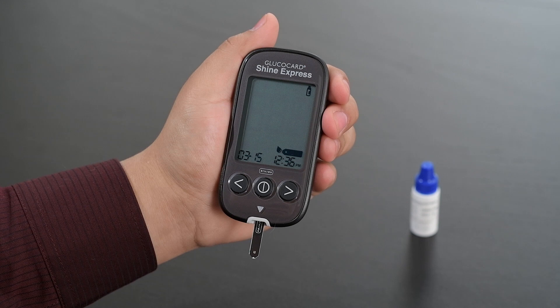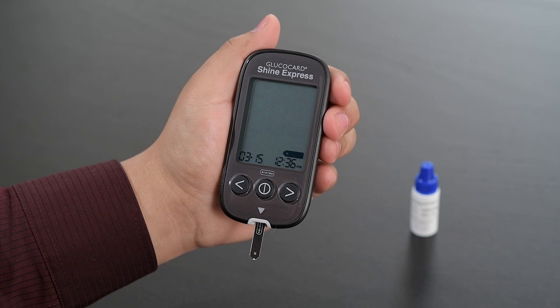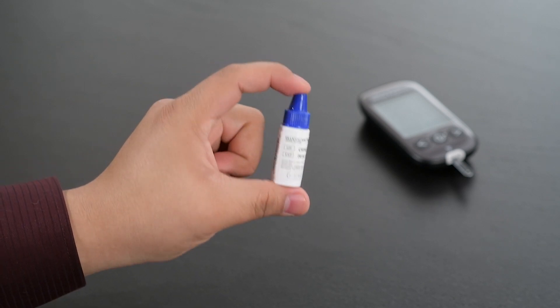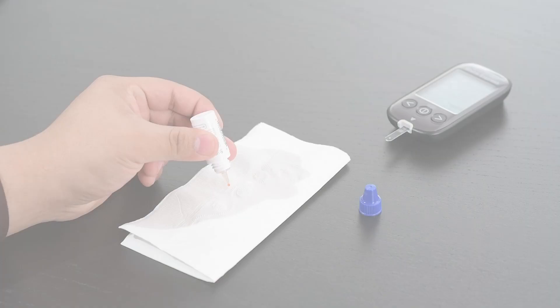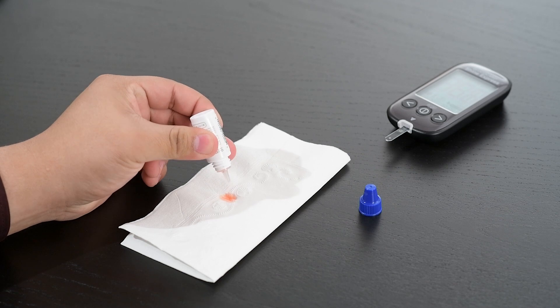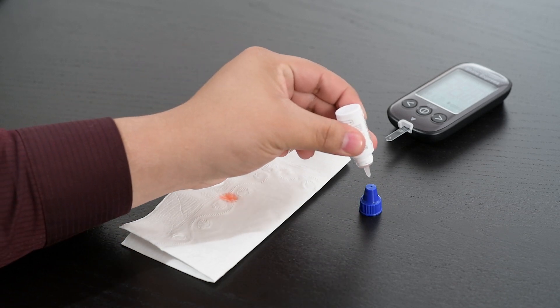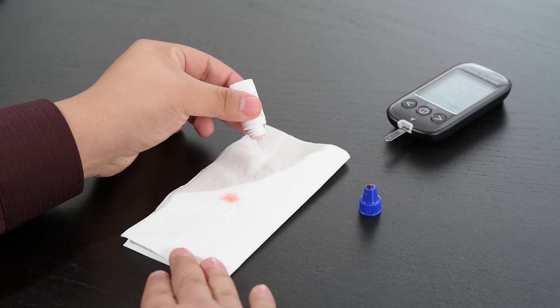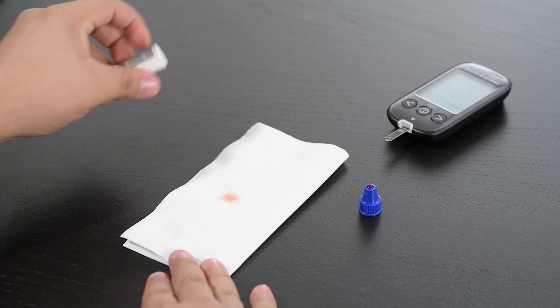You are now ready to conduct a control solution test. Shake the Glucocard Shine control solution and discard the first one or two drops. Dispense a drop of control solution onto a clean, non-absorbent surface, then wipe the tip with a clean tissue or cloth.